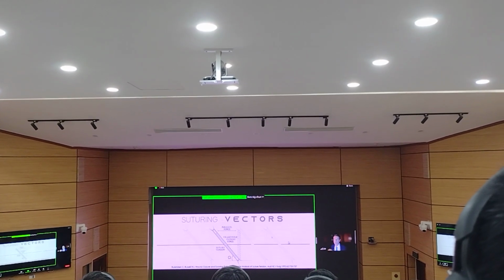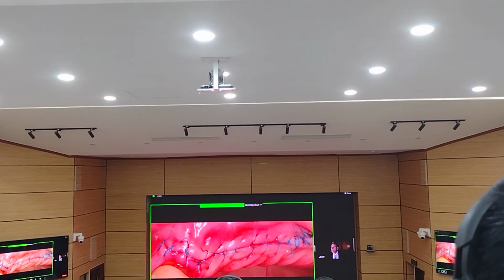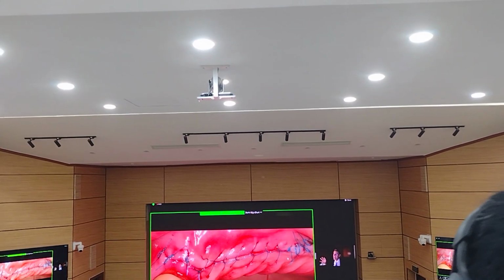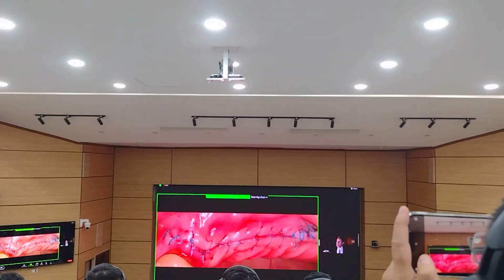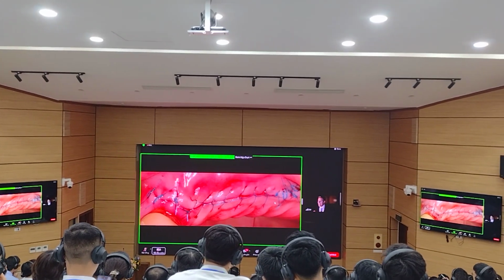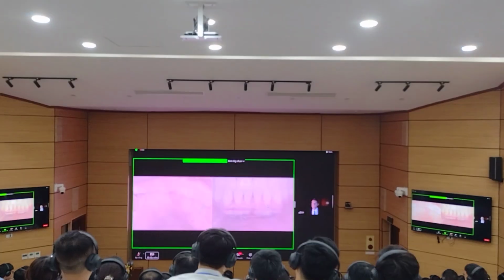They're going to require higher amounts of forces for us to achieve that type of approximation. Basically, because we're looking at separate individual components that are going to be linked together, and we need to make sure that all those links are maintaining structurally sound and with even compression alongside the wound.